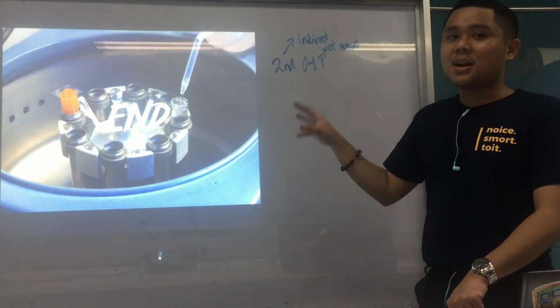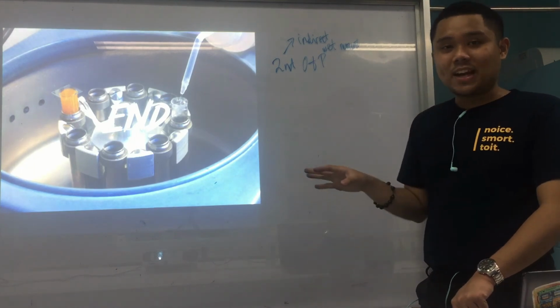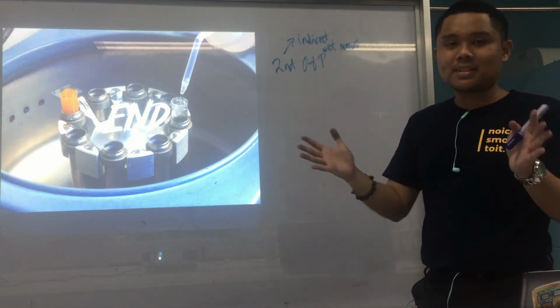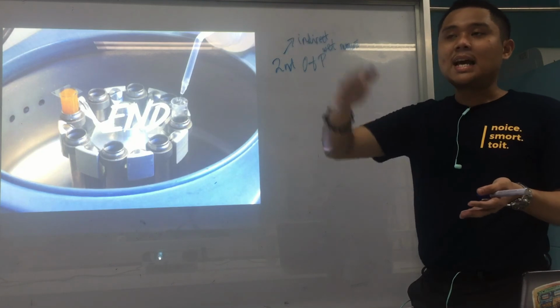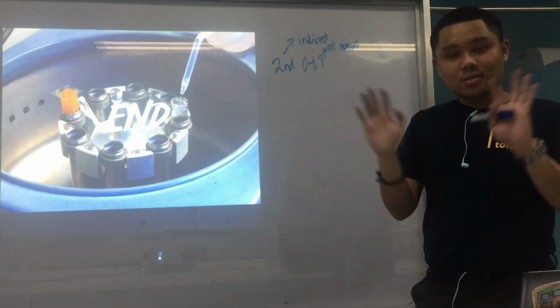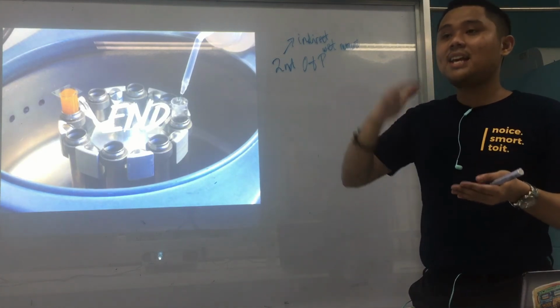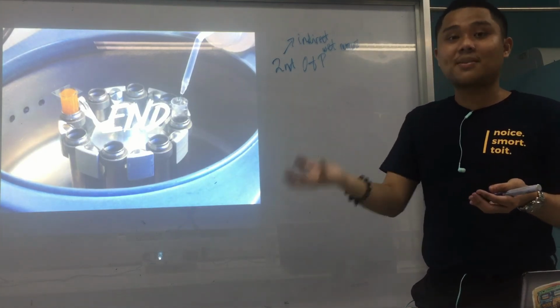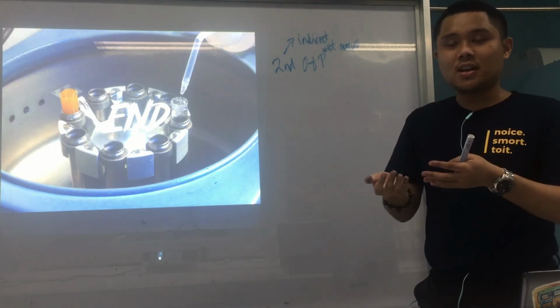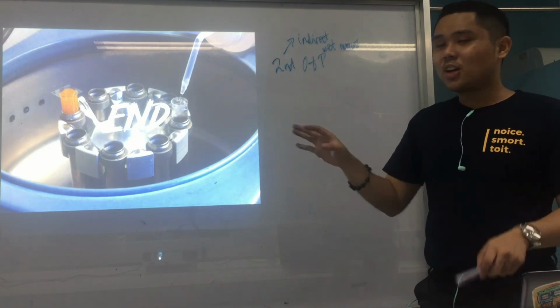All right, so again, those are the methods for concentration techniques: flotation and sedimentation. I hope you got the difference. By the name itself, flotation, parasites will float because they are less dense, they are lighter than the reagents used. And in contrast, sedimentation methods, they sink because they are much heavier this time than the reagents used. So you recover from the sediment at the bottom. Those are, again, concentration techniques.